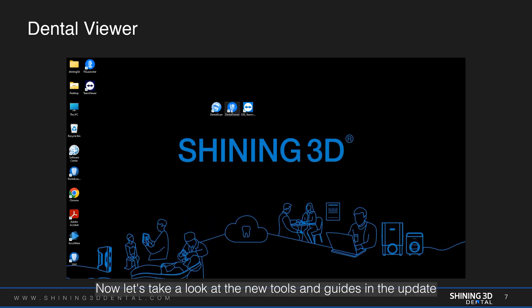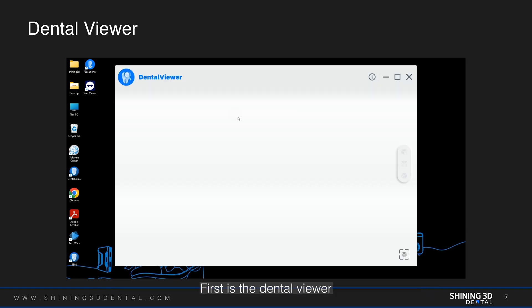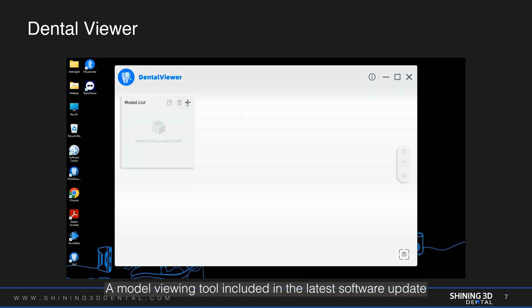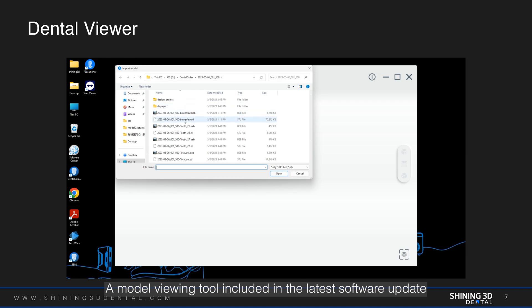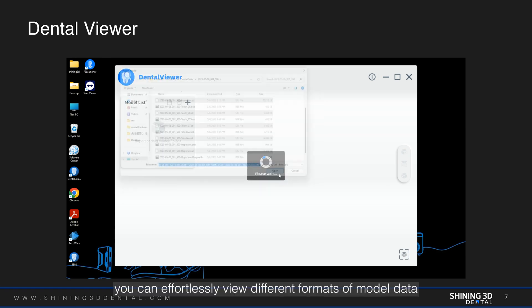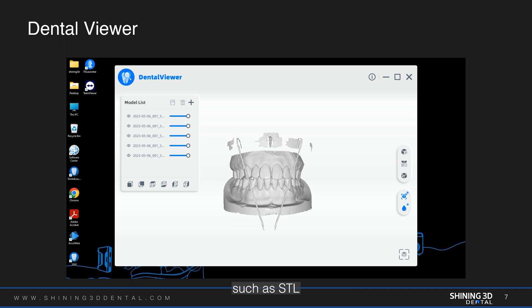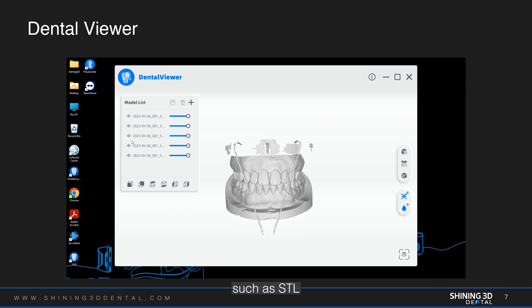Now let's take a look at the new tools and guides in the update. First, the dental viewer, a model viewing tool included in the latest software update. With this tool, you can effortlessly view different formats of model data, such as STL, OBJ, and more, without the need to open the scanning software.